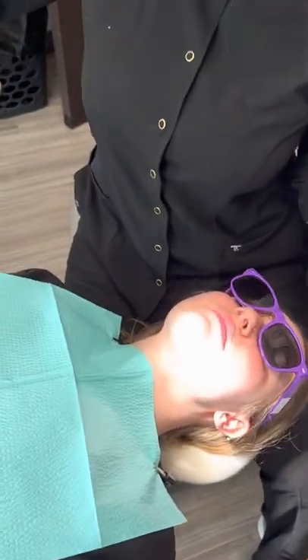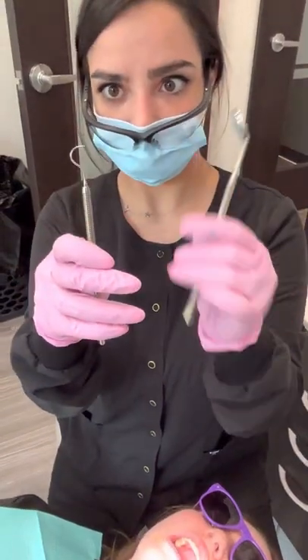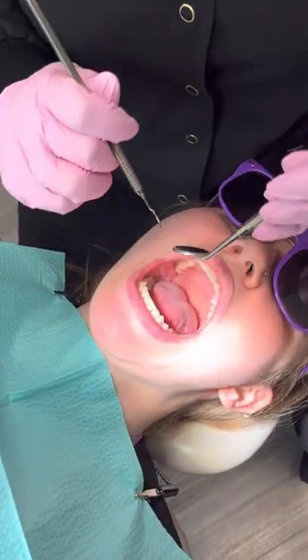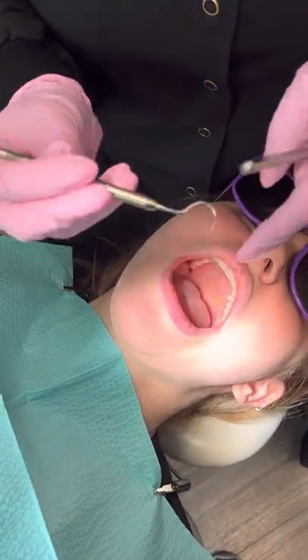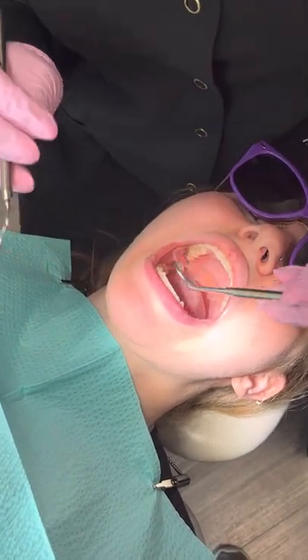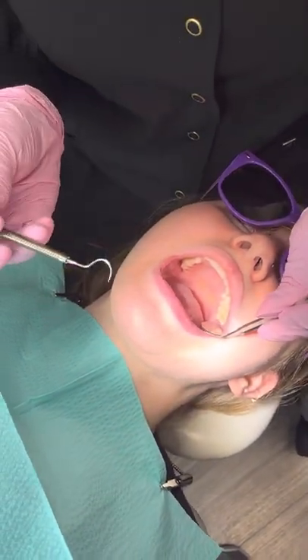Next we're going to pick up our mirror and our explorer. This is very sharp, so make sure that you're being careful not to hurt the patient. Have your patient open big. When placing these instruments in the mouth, you always want to do a sweeping motion — never just sticking things straight in, especially with this, because if you go through like that you could cut their lip. First thing I like to do is go to the upper left-hand corner.